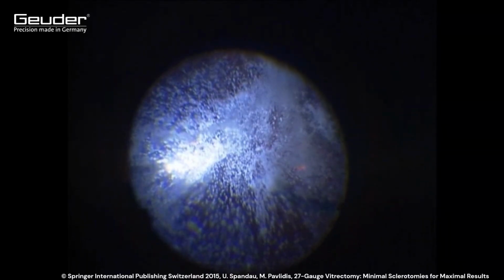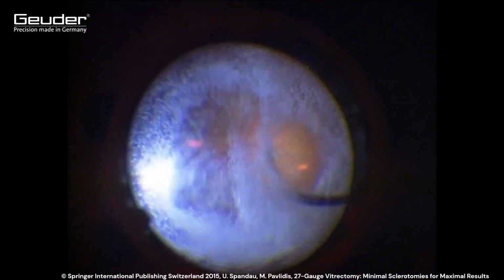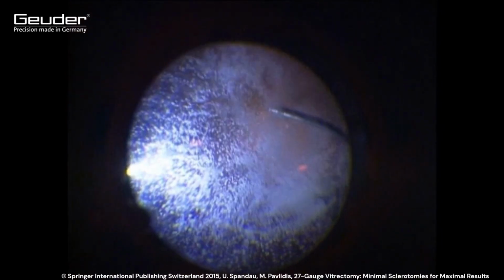You can now see the surgeon's view of the operating field. On the left, the light guide that illuminates the surgical area. Next to it on the right is the vitrector.